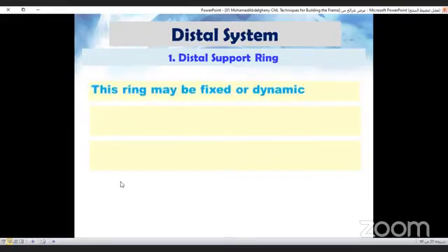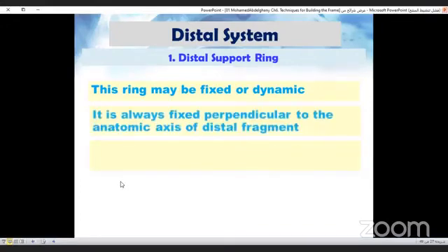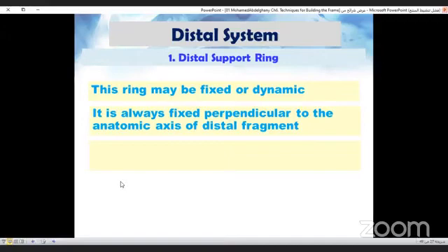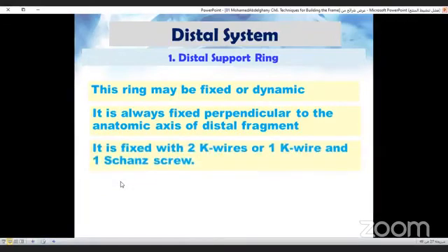The distal support ring may be either fixed or dynamic. It must be fixed perpendicular to the anatomical axis of the distal fragment, either with two K wires or one K wire and one Schanz screw.